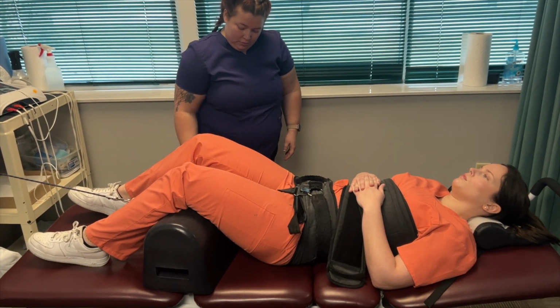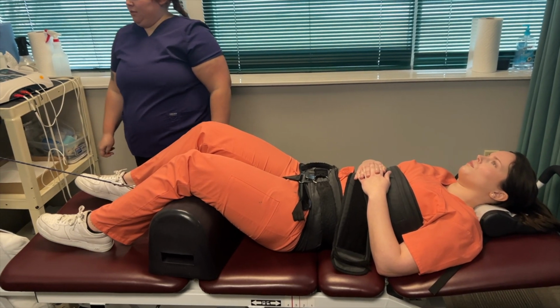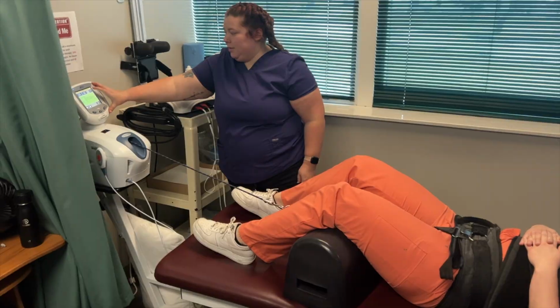Is this therapy mainly for low back pain, or does it treat other conditions? No, it does a great job across the spine. The main things that we use it for here in the clinic are lower back and neck pain.